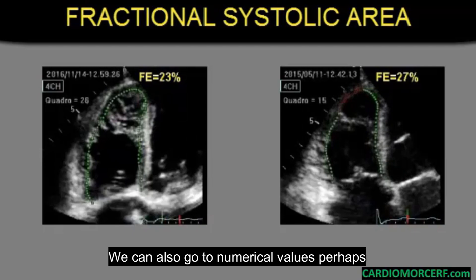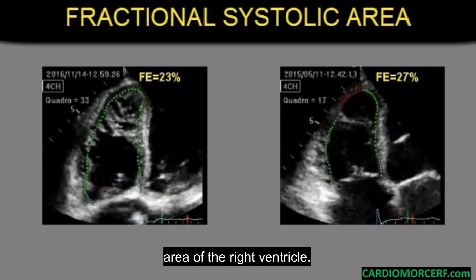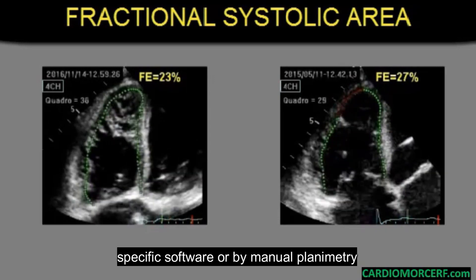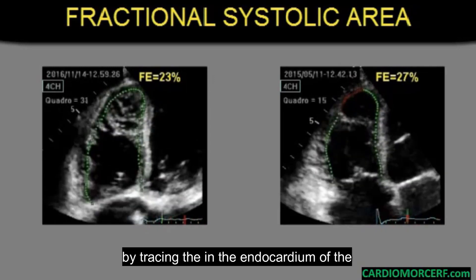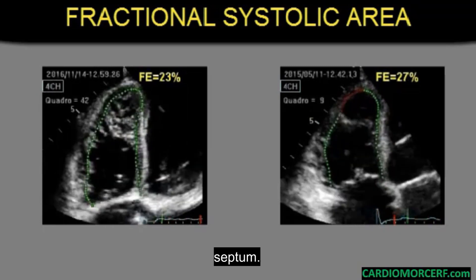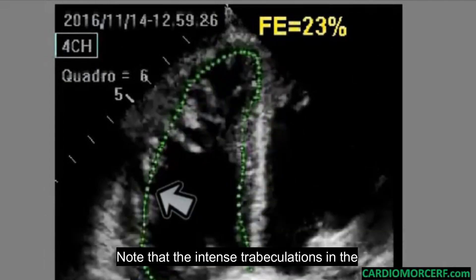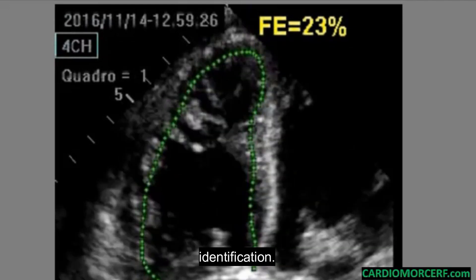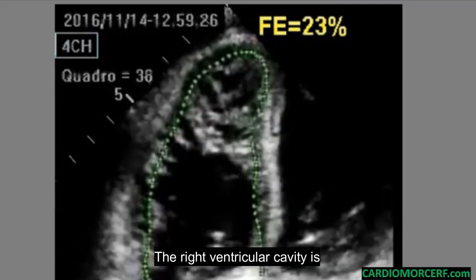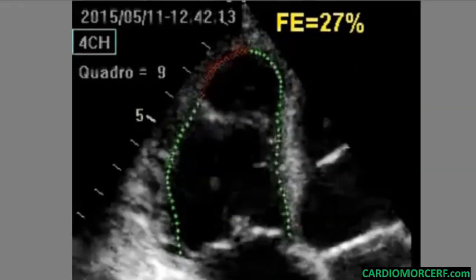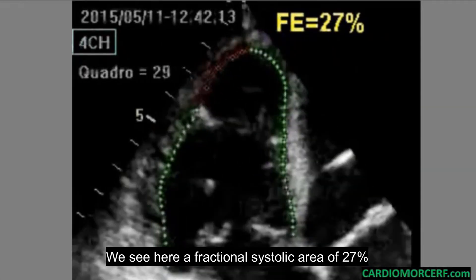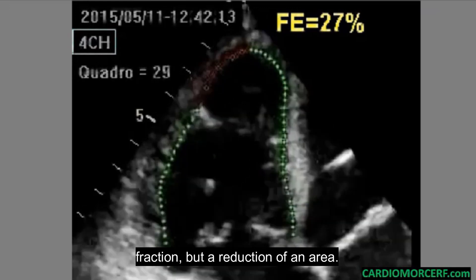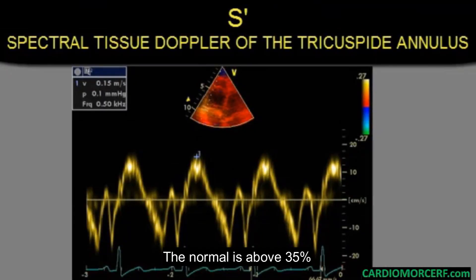We can also go to numerical values. Perhaps the main measure is the fractional systolic area of the right ventricle. It can be obtained automatically by specific software or by manual planimetry, by tracing the endocardium of the anterior wall and the interventricular septum. Note that intense trabeculations in the right ventricular cavity impair the edge detection software for endocardial identification — the right ventricular cavity is underestimated by automatic edge detection. We see here a fractional systolic area of 27%. Note that this measure is not an ejection fraction, but a reduction of an area; the normal is above 35%.